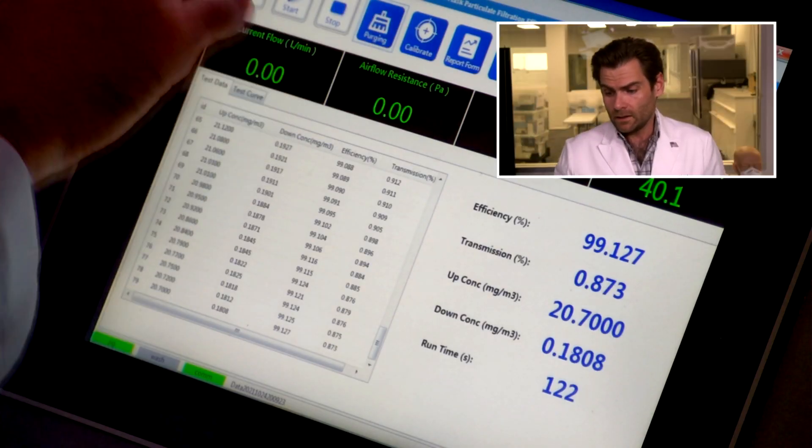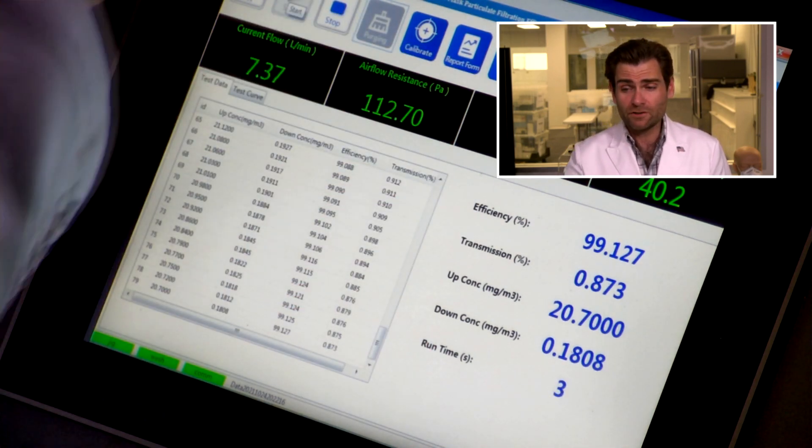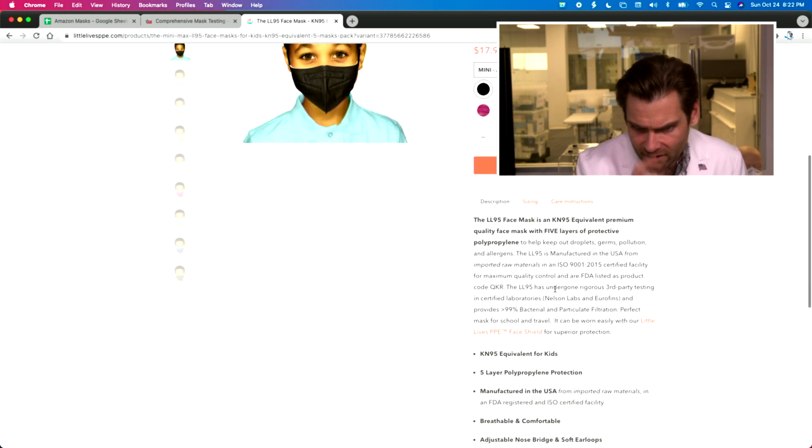Let's let her rip. This is a PFE machine — particulate filtration efficiency machine — and we are doing the N95 test here. Why are we doing the N95 test for something that's not an N95? Well, they are making some weird claims. It says 'LL95' — I guess Little Lives' KN95 equivalent for kids. So they're kind of claiming it has the KN95 standard.